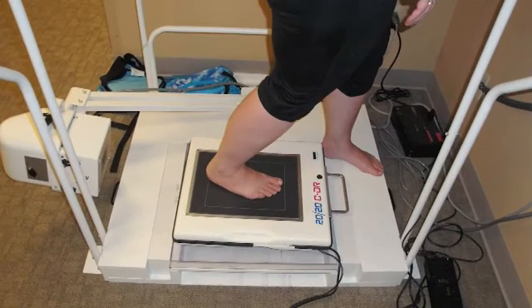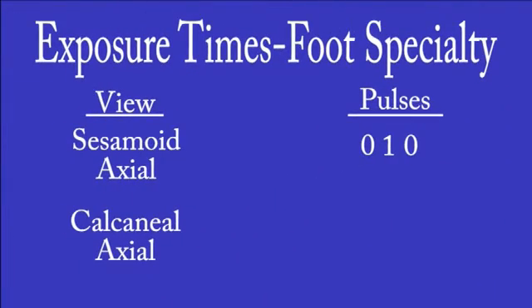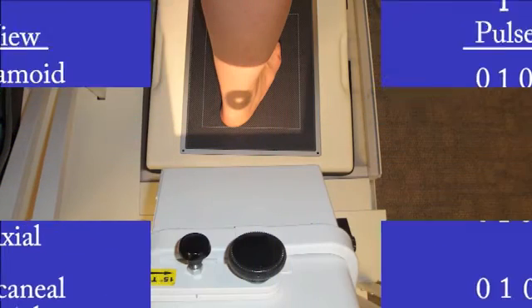Have the patient place their foot in the middle of the cassette and bend their knee forward while keeping their heel flat on the cassette. This allows the joint to be open and a better visual of the ankle and calcaneus to be seen. The pulses will be set much like the sesamoid axial at 010. Now take the X-ray.